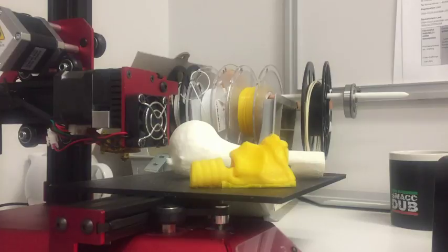I think 3D printing is a really useful tool, particularly for us in critical care, where we're trying to make trainers, task trainers, and certainly buying consumables can be pretty expensive. But with 3D printing, it's actually relatively cost efficient to replace those consumables. There are also different materials available on the market now.